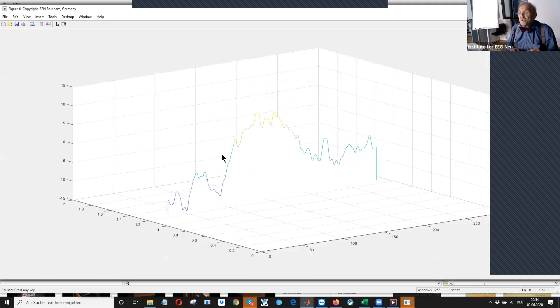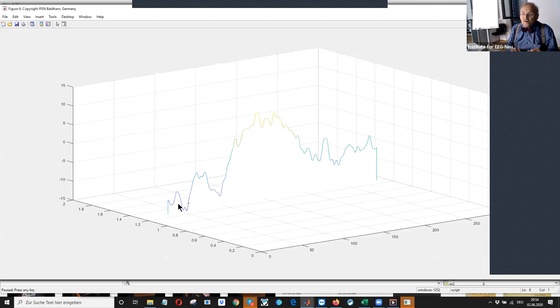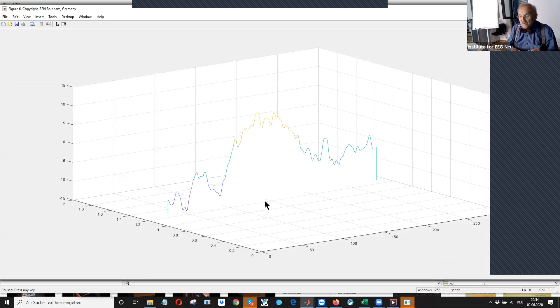We have already done it. This is a three-dimensional plot in MATLAB where you can see afterwards all. If you have more, you can look at them. Okay.